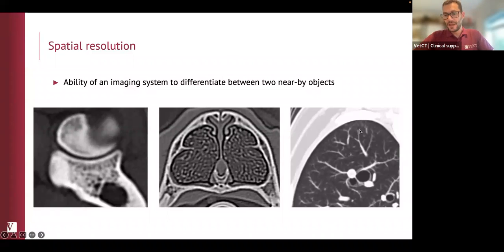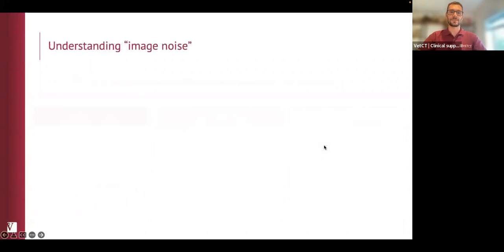So if the CT of the lung is of good quality, you should be able to see that mostly the only thing that you see in the lung is vessels, except in the periphery. So about 1 or 2 millimeters of lung peripherally looks almost like it's empty. And that's normal. What is happening there is that there are vessels, but they are so small that they are beyond our ability to resolve them. That's past the spatial resolution of the system. However, you should always be able to see vessels all the way into at least the fourth division, so the fourth branching of the vessels, and almost reaching all the way to the pleural surface.